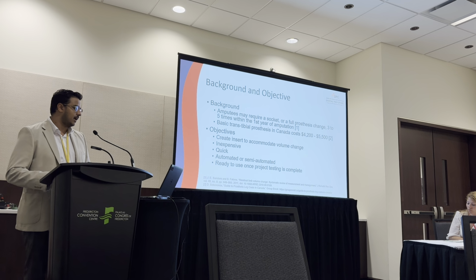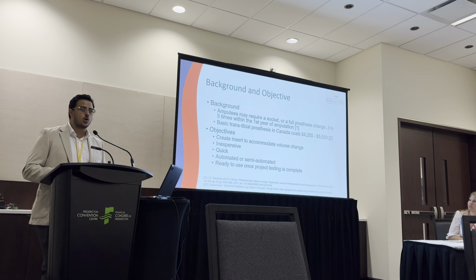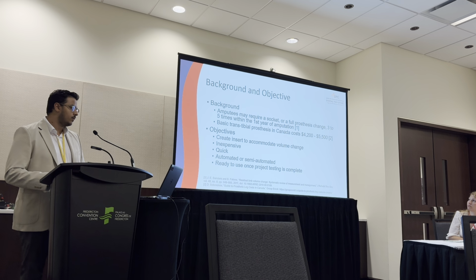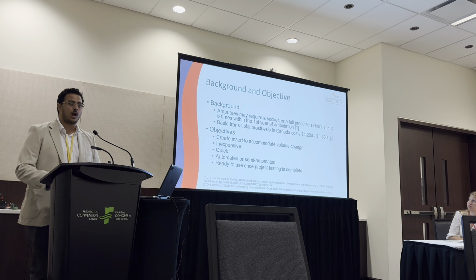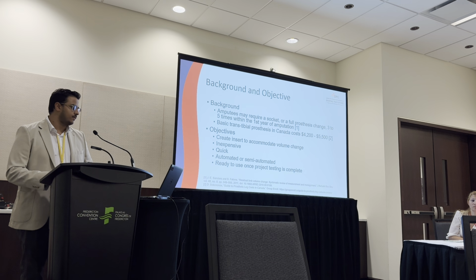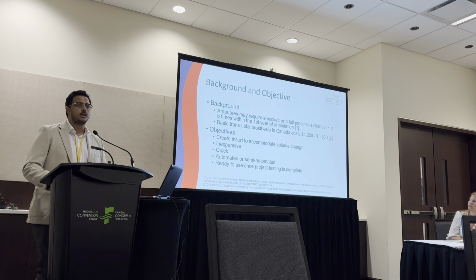And we wanted to create an automated or a semi-automated process so that it's easy for prosthetists to pick up and go without having to learn many new complex techniques to create the insert, which is what we're calling the device that we created. And finally, we wanted to create either a product or a workflow that's ready to use as soon as possible to help as many people benefit from the device as quickly as possible. It might not be the most streamlined process, but we wanted something that works right away without compromising on their care.